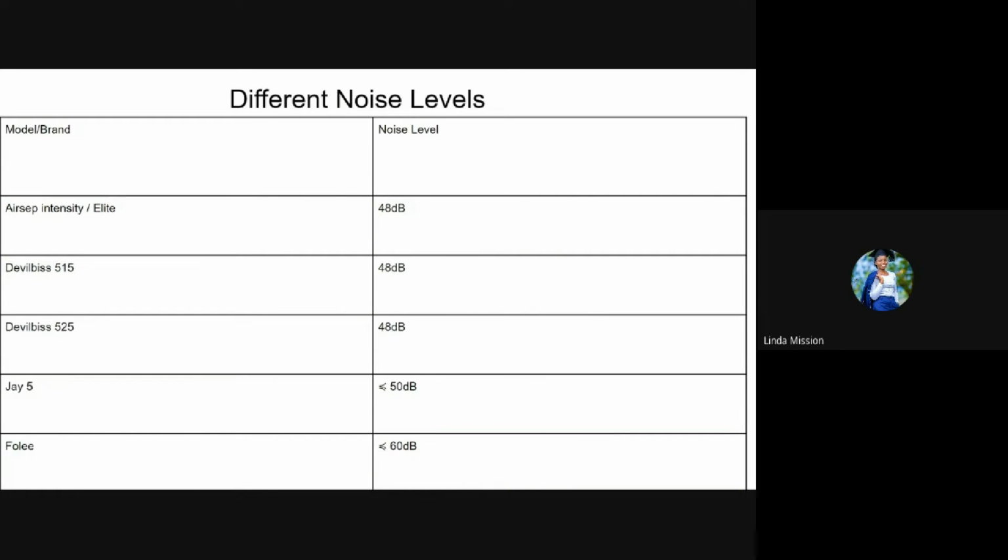Impacts of increased noise level from oxygen concentrators to the patients. One might wonder why we are talking about the noise produced by oxygen concentrators. If the noise level of your concentrator goes beyond the intended level, it may imply that something is wrong with your concentrator. And also, this high noise from oxygen concentrators can have an impact on the patients.